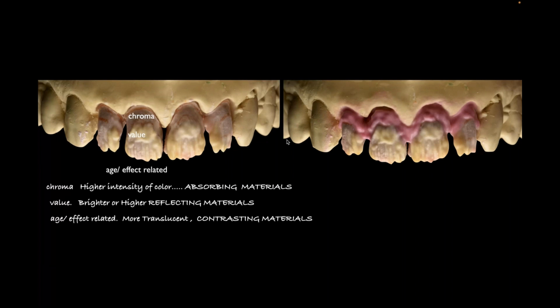So like I said, I won't go too far into the buildup. I think you guys will get the concepts already because I've done this so many times, where I always want more chroma in the cervical. I want to brighten that middle third and get that value up.